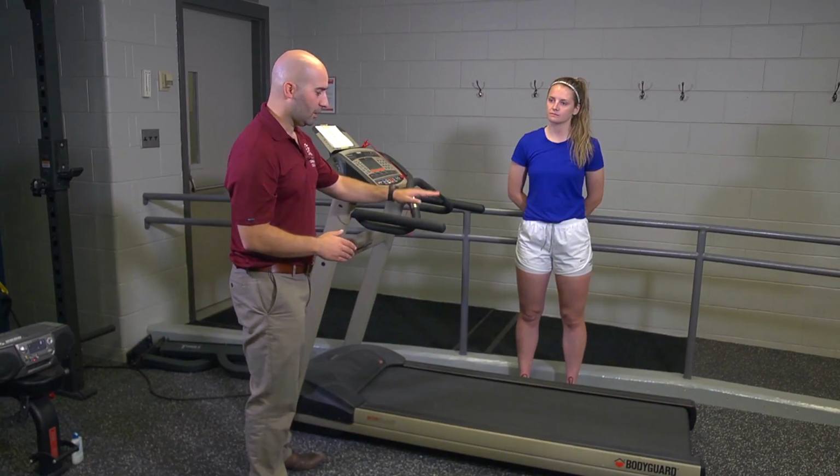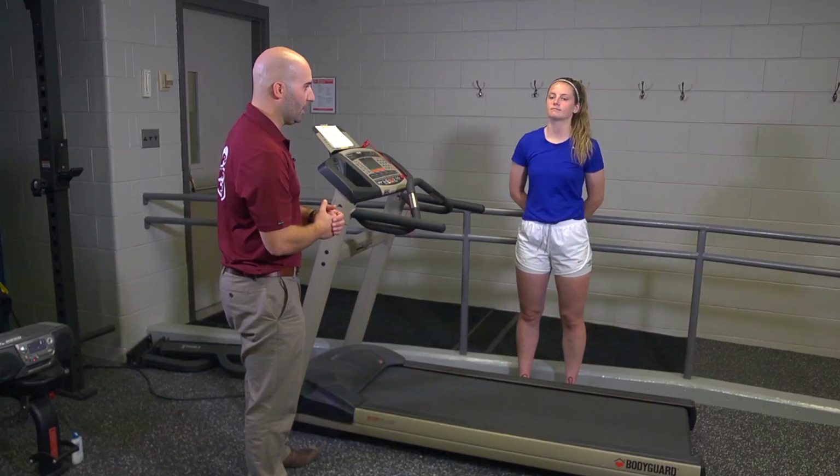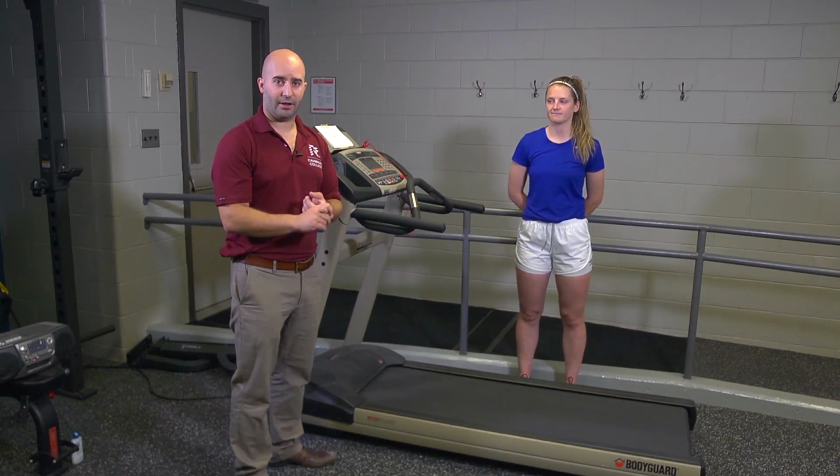The other thing is we need to go through some proper safety. So you might want to ask your client if they've used a treadmill before. A lot of clients don't know this, but you should never close your eyes when you're walking on a treadmill.